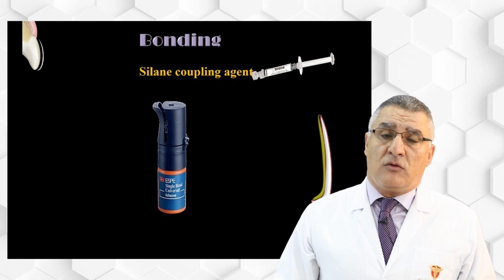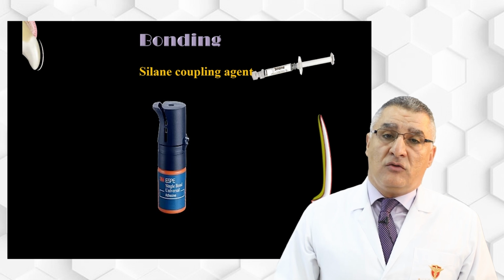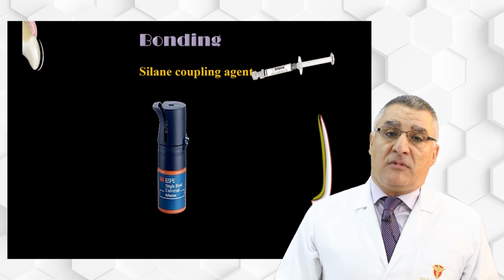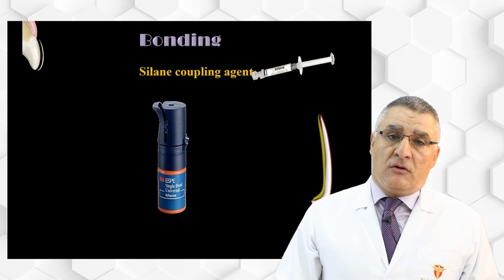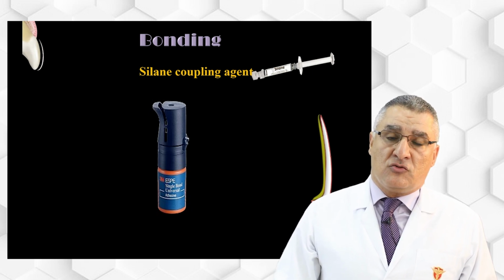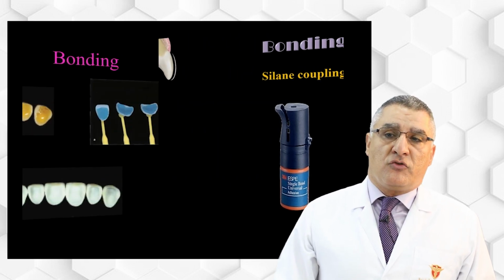So silane coupling agent is very important to be used to provide chemical bond between the resin and the ceramic. Nowadays we have what we call universal adhesive. Some universal adhesives include silane in their composition. So with this type of adhesive, you can use it without separate silane application. But you have to check your universal adhesive. If it contains silane, you can use it. If it does not contain silane, you have to use a separate silane portion.